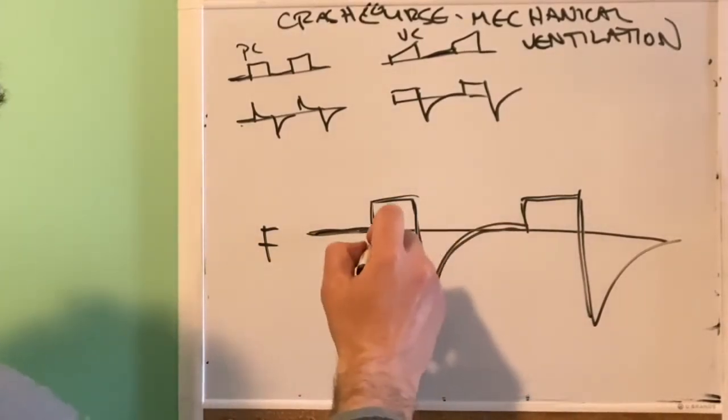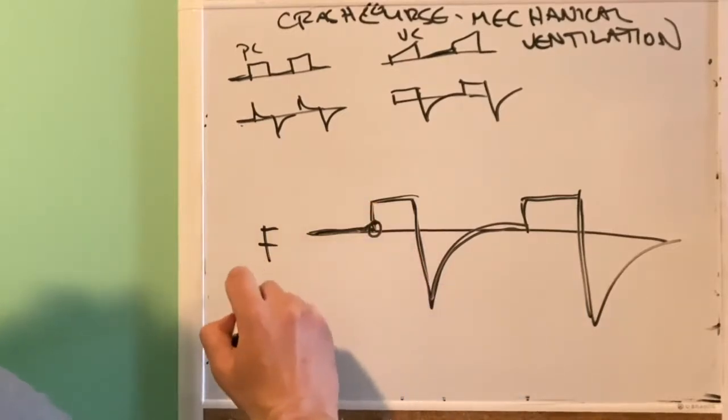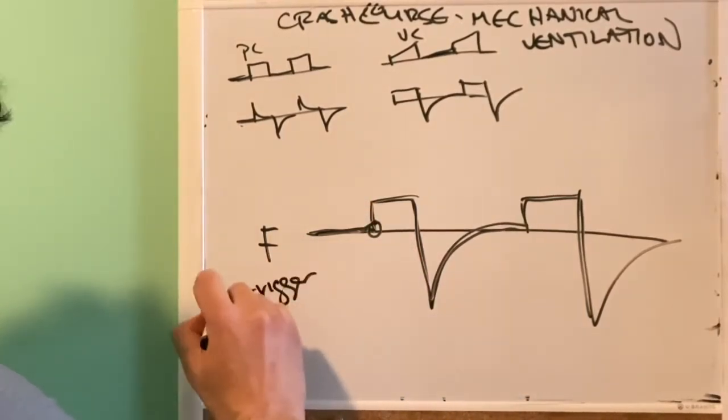All right, and so let's take here. So first, this is the trigger. So you can have trigger desynchrony.